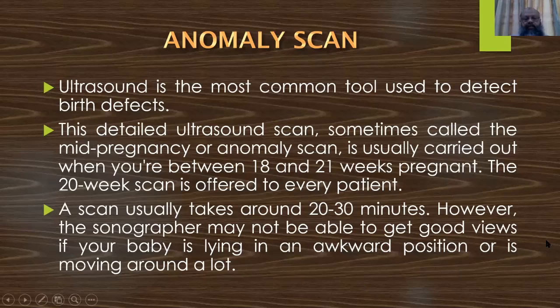Anomaly scan. Ultrasound is the most common tool used to detect birth defects. This detailed ultrasound scan, sometimes called the mid-pregnancy scan or anomaly scan, is usually carried out when you are between 18 to 21 weeks pregnant. "You" means the patient.